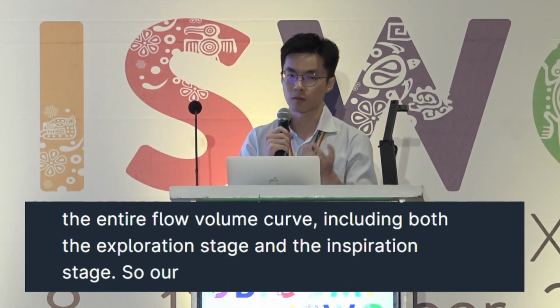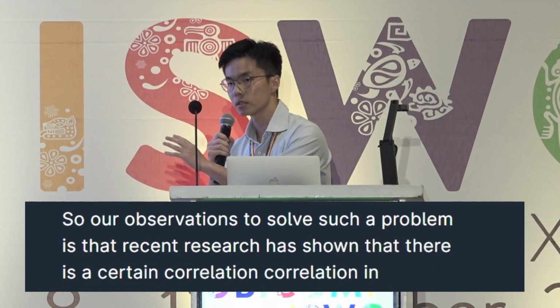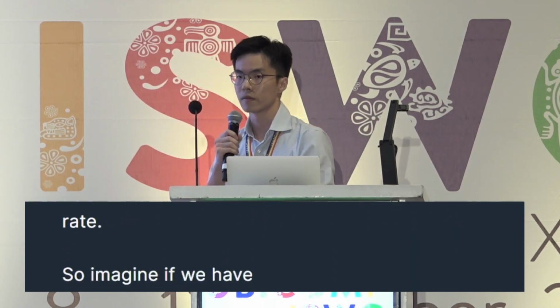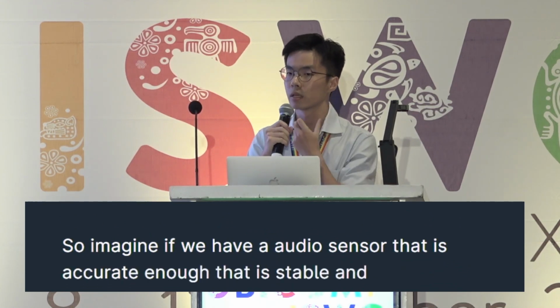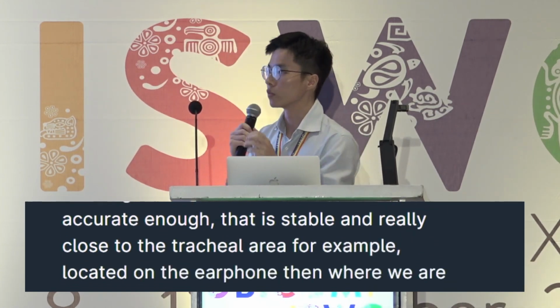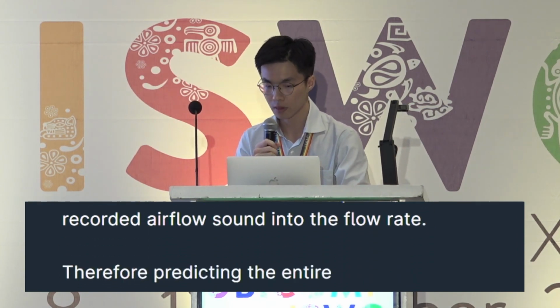Our observation to solve such a problem is that recent research has shown that there is a certain correlation between the airflow sound and the actual flow rate. So imagine if we have an audio sensor that is accurate enough, stable, and really close to the tracheal area, for example, located on the earphone, then we're able to interpret the recorded airflow sound into the flow rate, therefore predicting the entire flow volume curve.